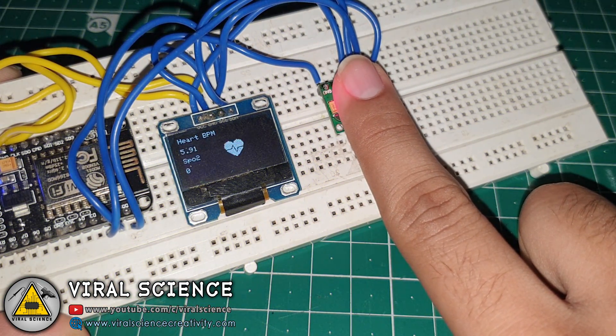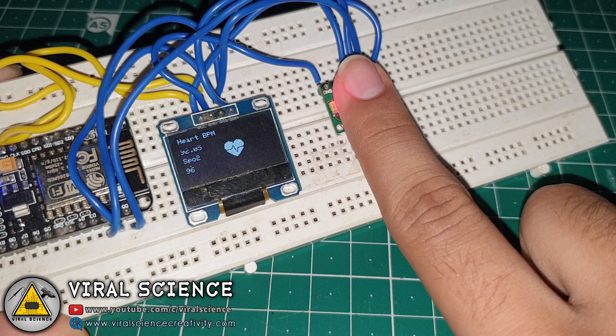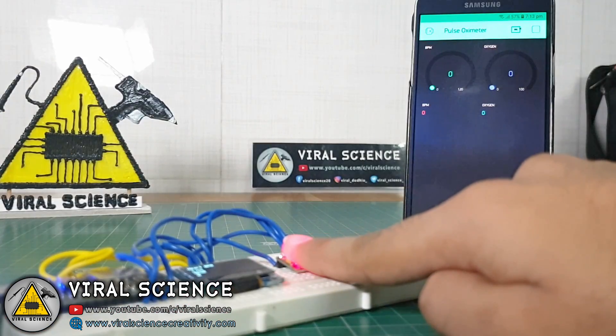So now this project is ready. Just place your finger on the sensor and it will display the values of your pulse rate and the oxygen level in your body. Similarly you can view these values on the display as well as on your smartphone via the Blynk application.